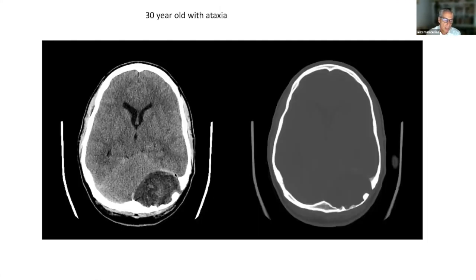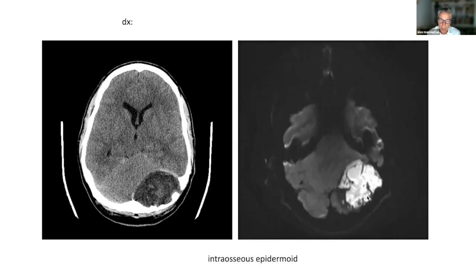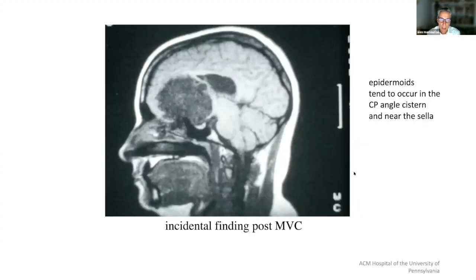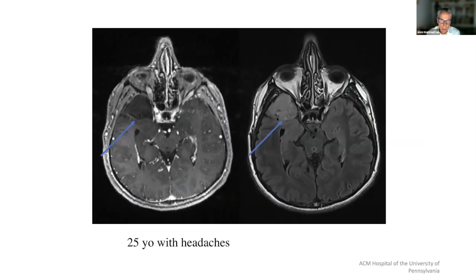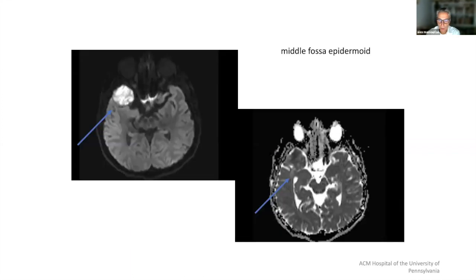I want to distinguish that from this entity: a low signal intensity or low attenuation mass in the brain with some scalloping in the bone — not frank destruction, more remodeling. This is what it looks like on the diffusion scan. Here is a different patient, and another patient, with similar disease. You can see the lesion — it is not as bright as a chordoma and does not enhance. These are all epidermoids. To summarize: metastatic disease, chordomas, chondrosarcoma, and epidermoid. Enhancement and bone destruction should lead you away from epidermoid.